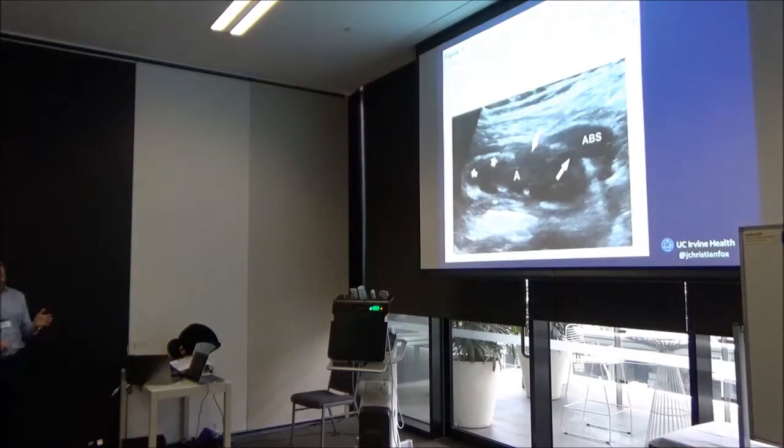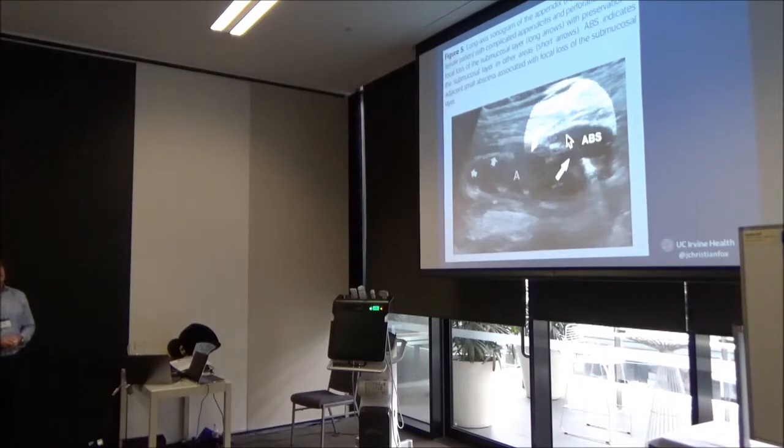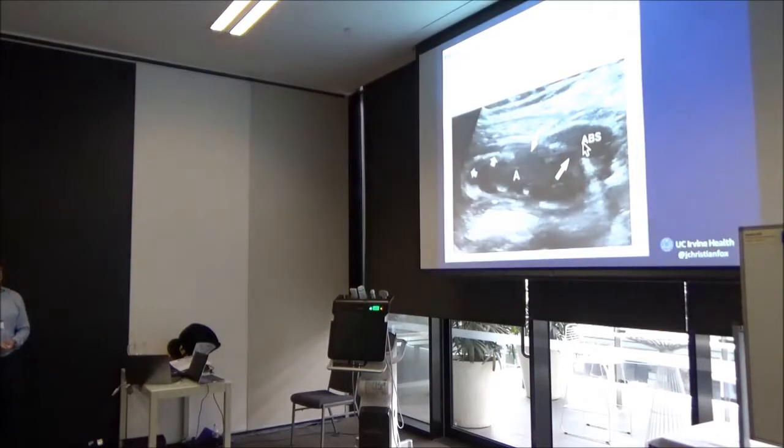And this was an interesting one here. This is an 18-year-old female. They said she's got some submucosal layer over here, but this is complicated appendicitis with a periappendiceal abscess from loss of that hyperechoic submucosal layer as you come along here, and then perforation into where the abscess was. They said this is where the perforation likely occurred. But you can see there's submucosal layer here, and then boom, it's gone, and then there's perforation.